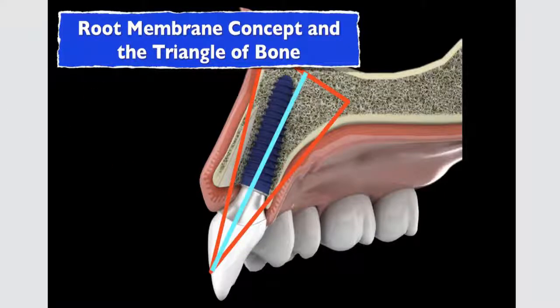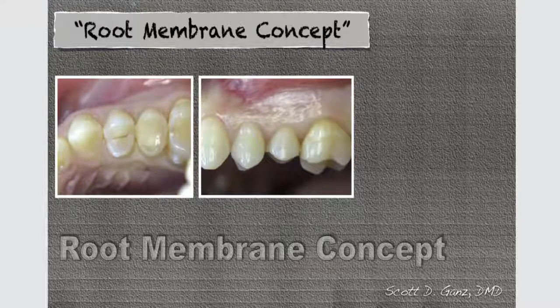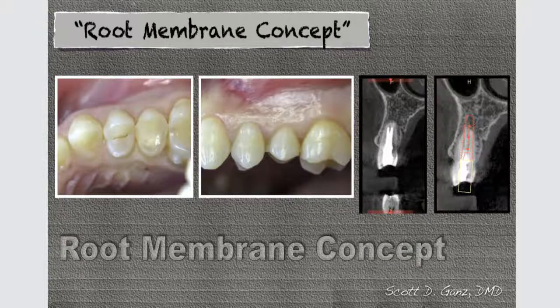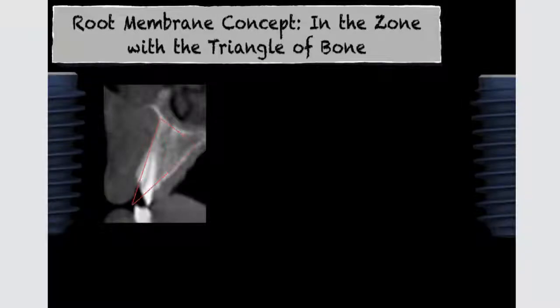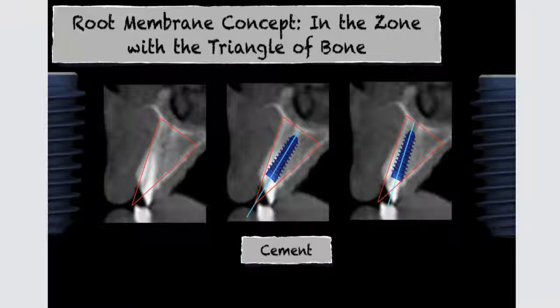So when we look at the triangular bone concept, we want to be able to position the implant, and we also want to avoid hitting that root fragment when we're doing partial extraction therapy. So again, in coordination and collaboration with 2 wonderful clinicians, Dr. Isaac Towell and Miltiades Mitzias from Athens, Greece, we're able to visualize a case like this, where we're going to plan to section the root of a tooth similar to this.